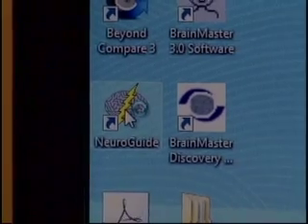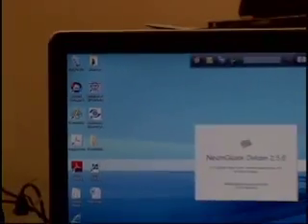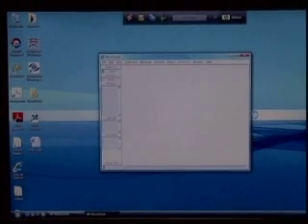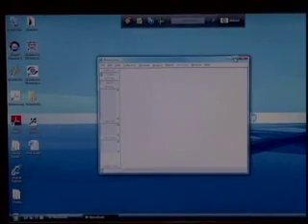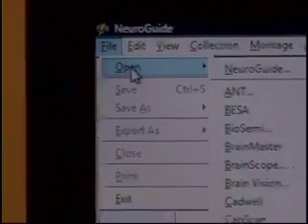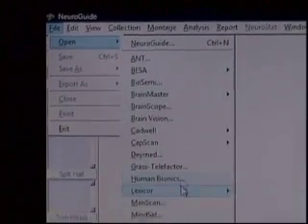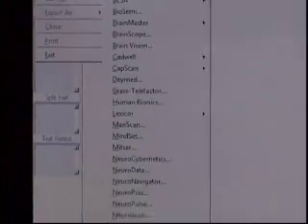But however you start NeuroGuide, it comes up and you get the beginning screen for NeuroGuide. I like to expand it. Similar to EDF Browser, in NeuroGuide we're going to go File, Open, and then go all the way down to EDF, European Data Format.